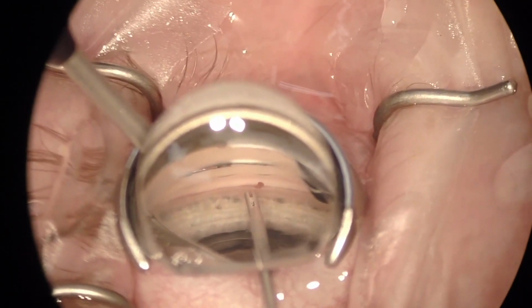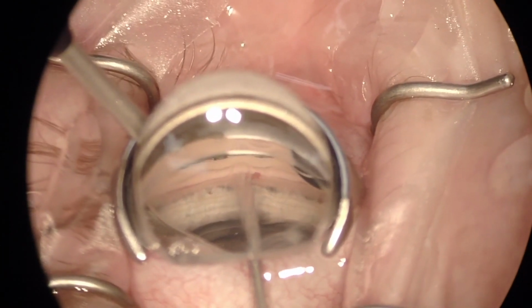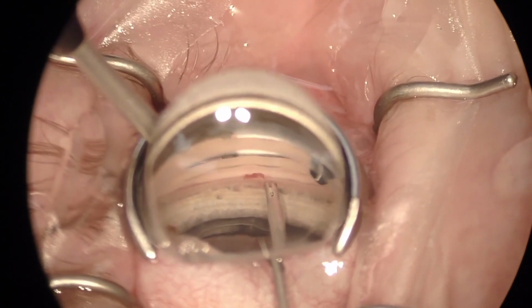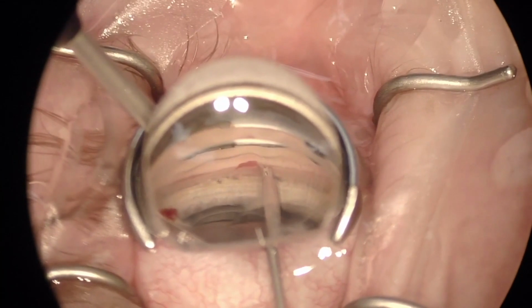So I want to have a good view, so I move over just slightly, and I can show you by pushing in too far, you can get some corneal folds. And so again, I had some bleeding. I don't like that spot, so I move over just a tiny bit and get that stent in good position.